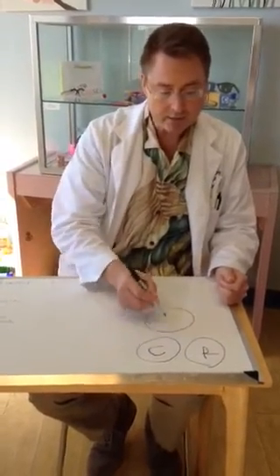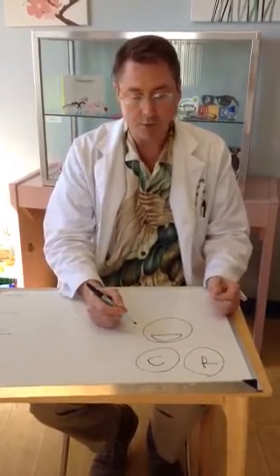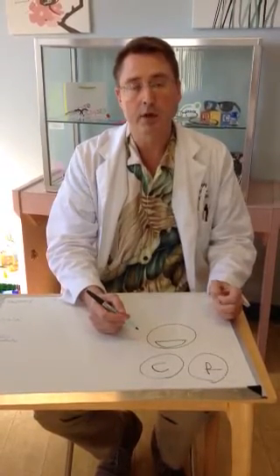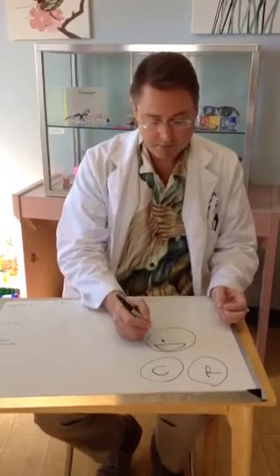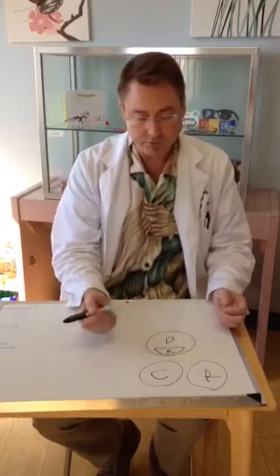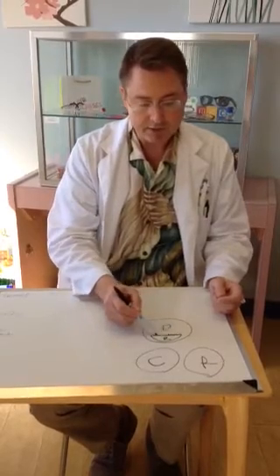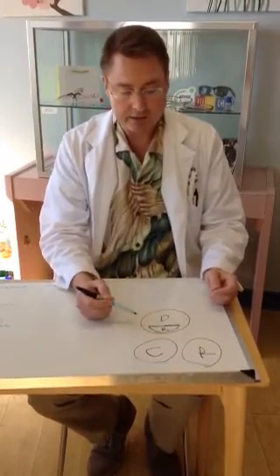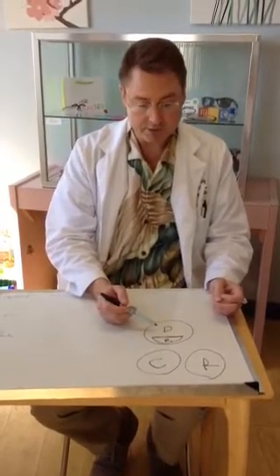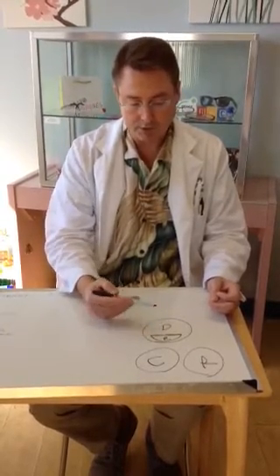The idea that we used to be the only idea we had for doing two things at once was the bifocal. This was invented by Benjamin Franklin's optician, so it's been around a long time. The idea is the top portion here is for distance, and the bottom portion here is for reading, for up close. The drawbacks are it does only two things, and cosmetically there's a line that runs through the center of the lens. The idea is you have this distance portion for driving, movies, television, and you jump over the little line and then you go into a full reading portion that's close up.